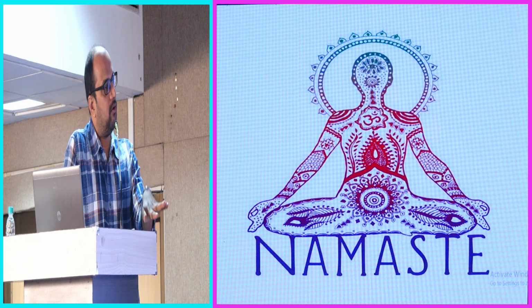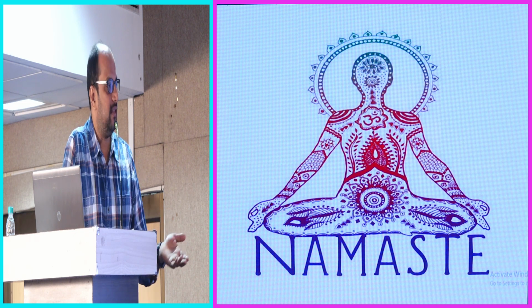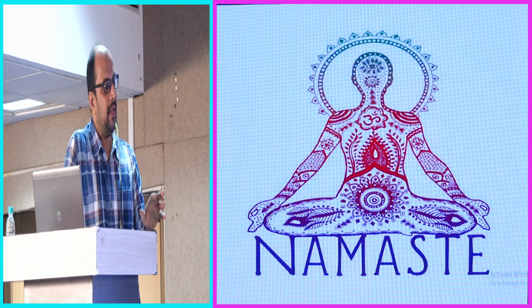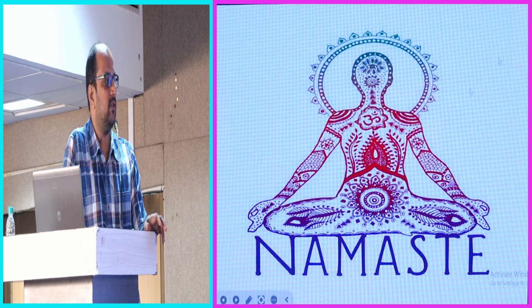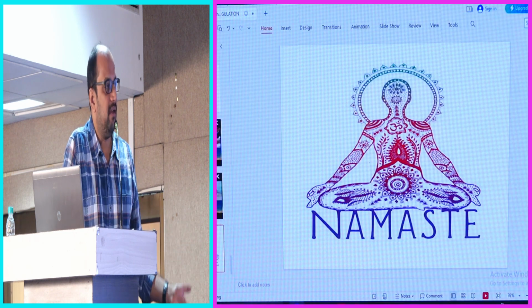But because the platelet count was very low, our critical care team asked us to give fondaparinux. But it is not a great drug to keep the circuit patent, so I used citrate in that patient. On one side I used fondaparinux as treatment for heparin-induced thrombocytopenia, and to keep the circuit patent I used citrate anticoagulation. From my experience till now, if you ask me what my filter life is, I can say infinity, because none of the patients on citrate-based anticoagulation had the set clot.